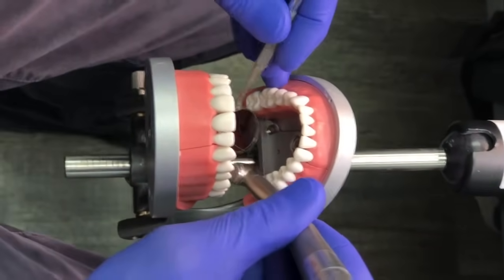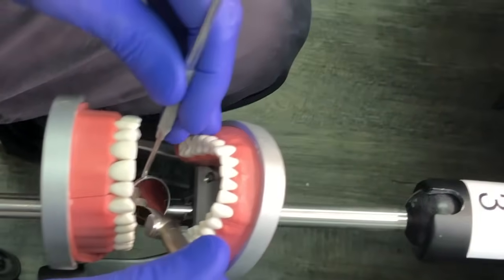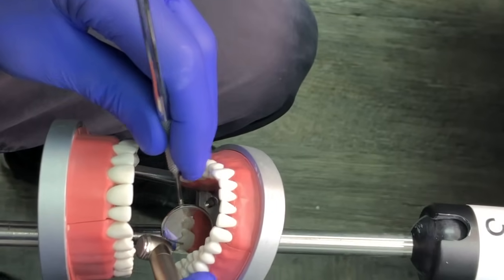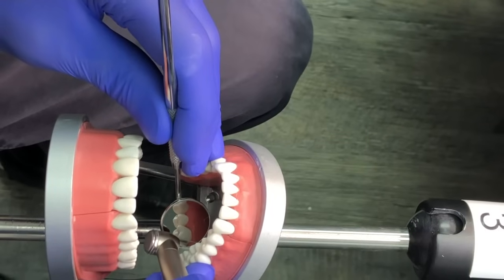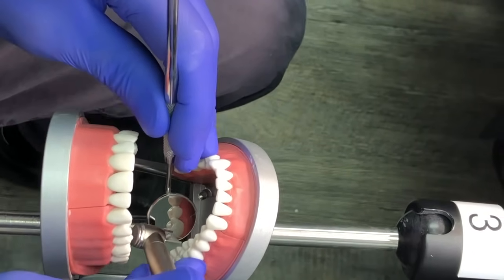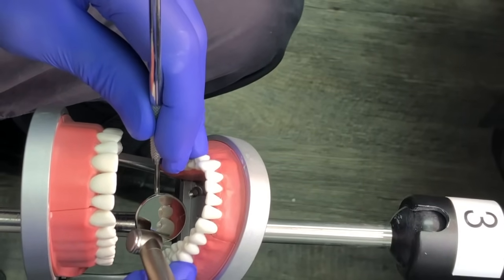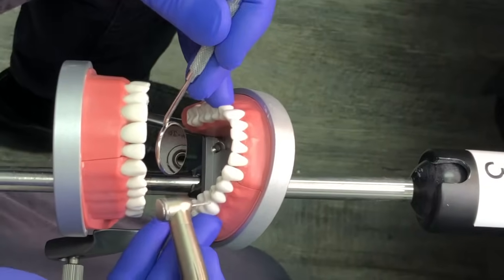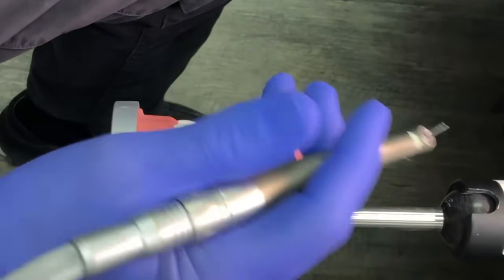When people are working on the distal lingual and trying to hold the mirror above, they can't see — you need to put the mirror off to the side or in front. Another helpful technique when working on difficult areas: do a couple of trial passes first. Run the handpiece but don't touch the tooth — practice the stroke before you lay into it, so you really know which direction you're going.